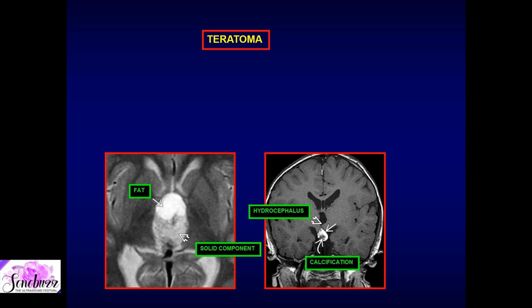The T1 hyperintensity here is truly fat, because mesenchyme is included in this neoplasm. Situated along the CSF outflow path, it again causes hydrocephalus. On contrast, there is enhancement in the solid component. The signal fallout on T1 is due to calcification. As opposed to dermoid, there is no fluid-fluid level here — it is a purely solid and cystic lesion with enhancement and calcification.